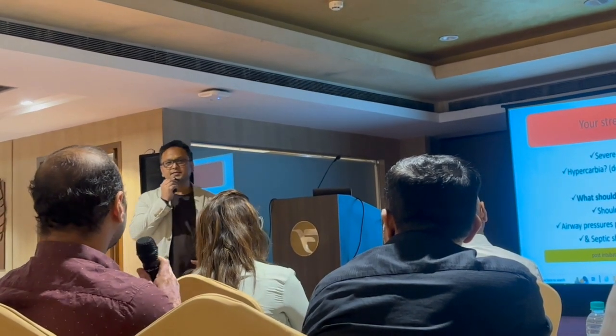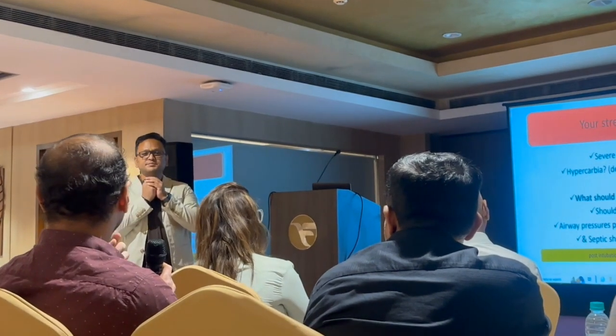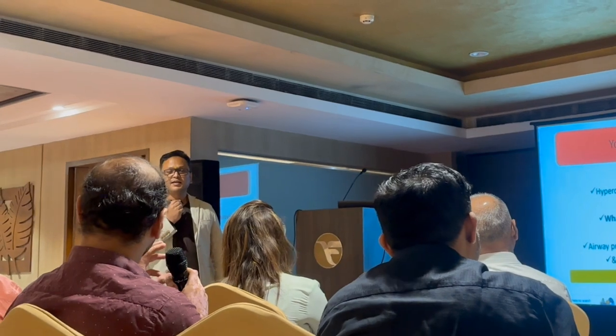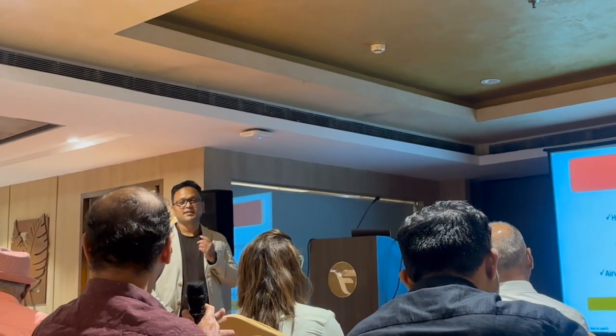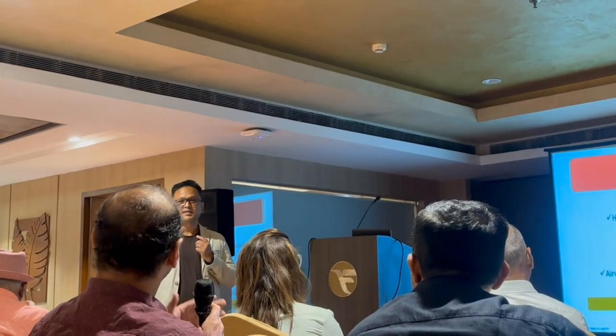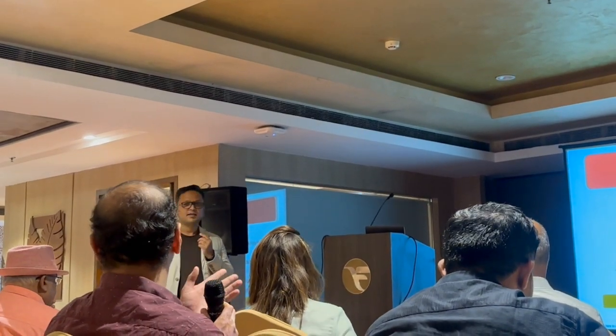Sir, first of all, my concerns, as we have already mentioned, the patient is severely hypoxemic. The second concern will be whatever fluid we are giving, the resuscitation, whatever we are doing, what is going to be the harm to the organs. Then third will be whether our ventilator strategies, what we have initiated, are appropriate or not. Like initially we have given the 10 ml per kg. So that should be 6 to 8 ml nowadays.